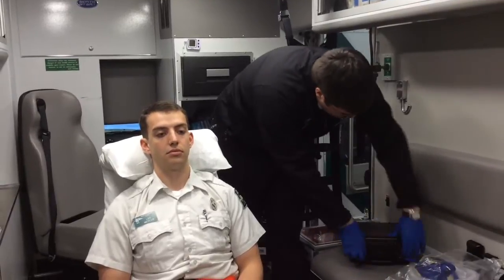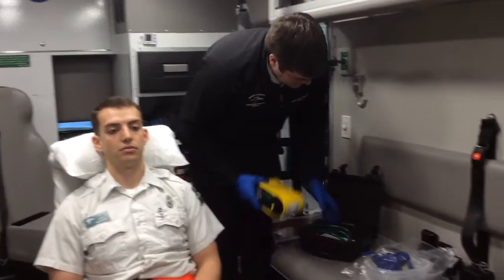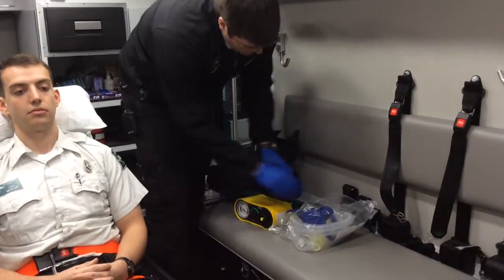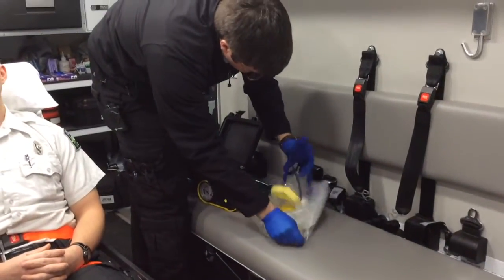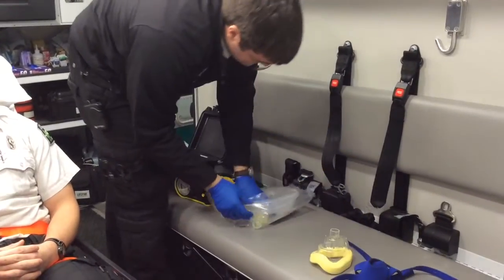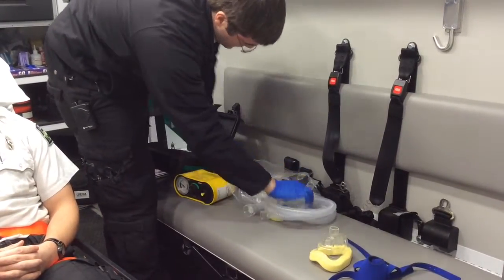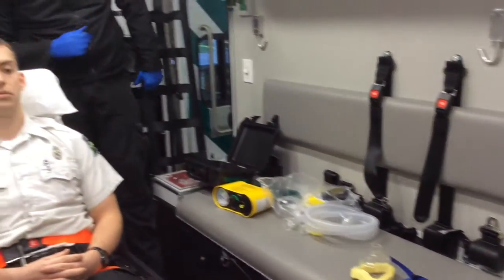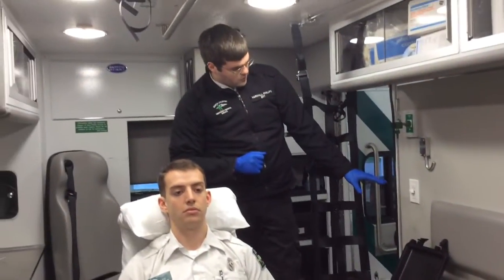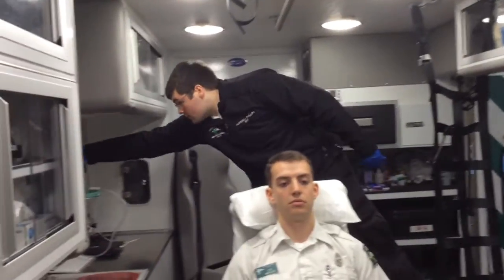Start by taking our equipment out and laying it out. This is the North Country EMS CPAP. We have the hose, mask, straps, hose, and filter. We have four ports which we can attach the air to — one, two, three, and four.